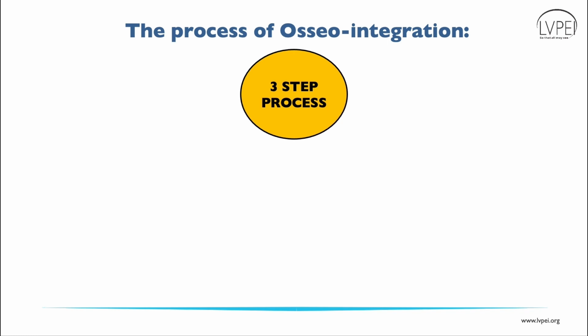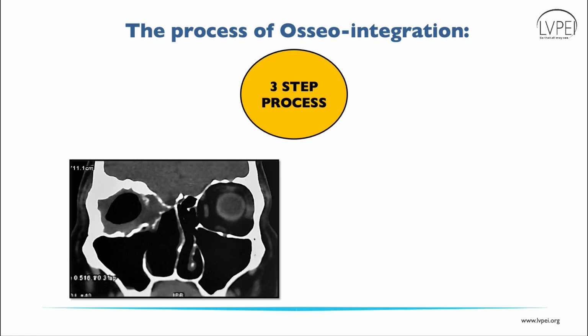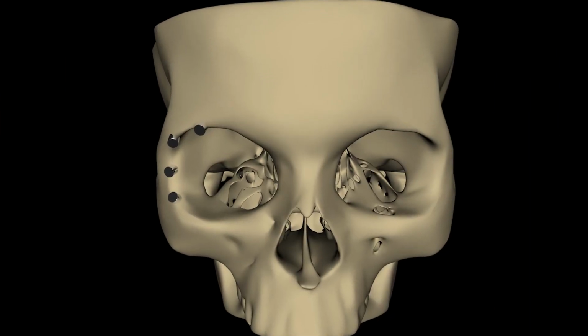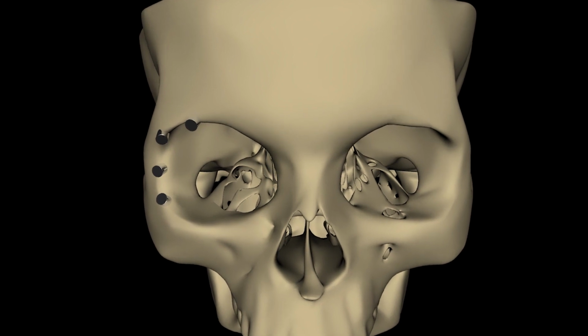First, it's important to choose the correct size of implant which can sit into the orbital rim. The most commonly chosen are the supralateral and the lateral part of the orbital rim, as there is a good cortical thickness of bone here. A pre-operative CT orbit helps to determine the dimensions and decide on the position of implants. 2 adjacent implants should at least be 1 centimeter away from each other.